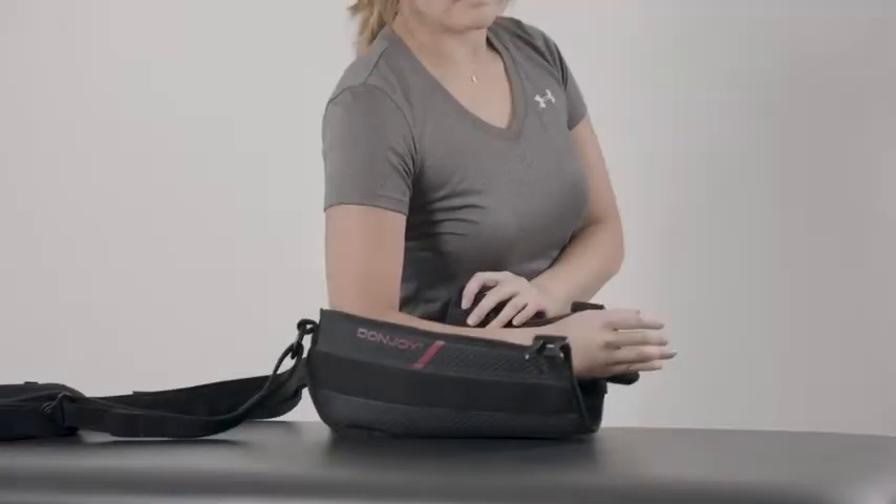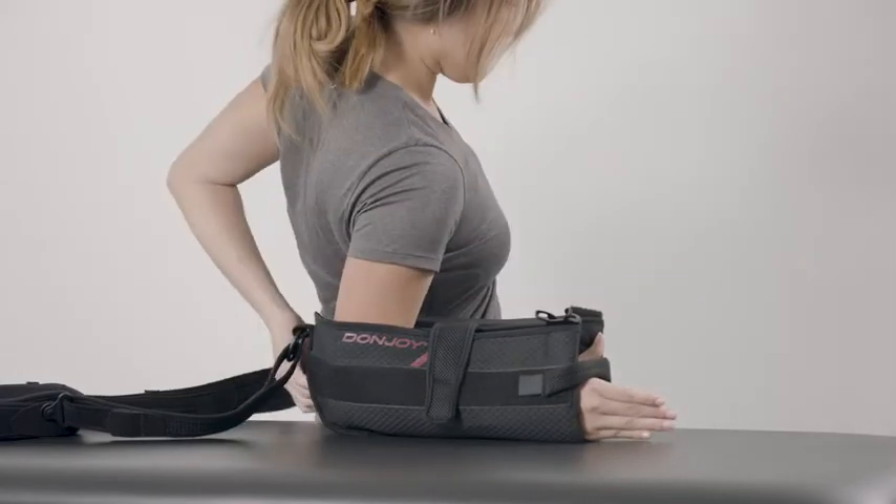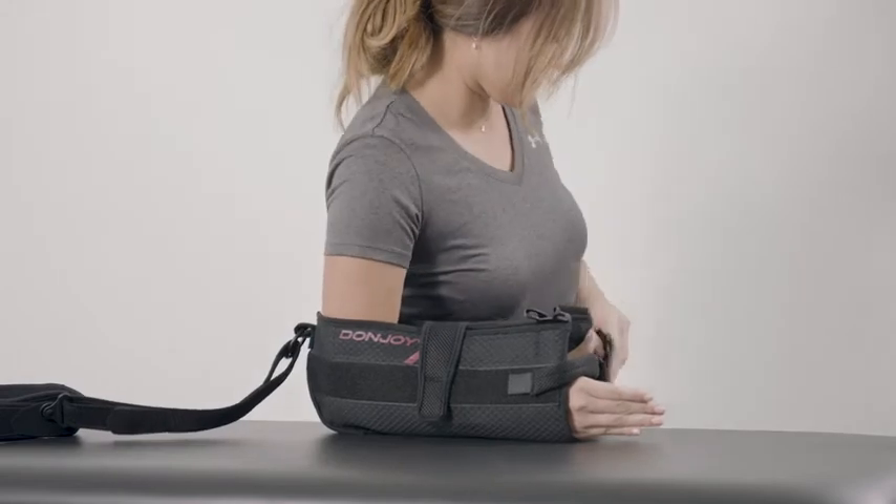To reapply, place the forearm in the arm sling. Secure the forearm and thumb straps. Bring the waist belt around to the front of the cushion and secure the quick release buckle.